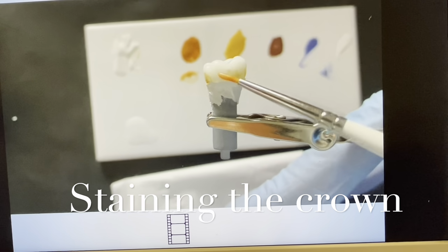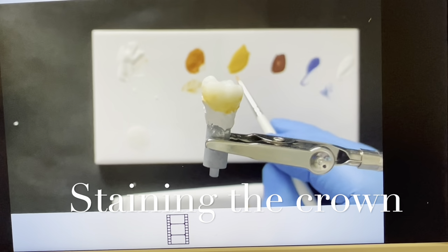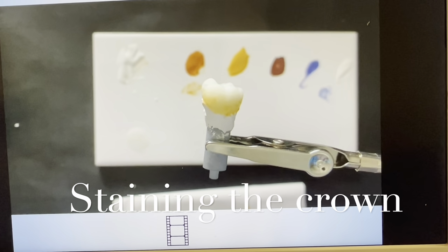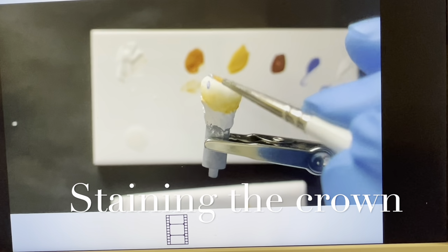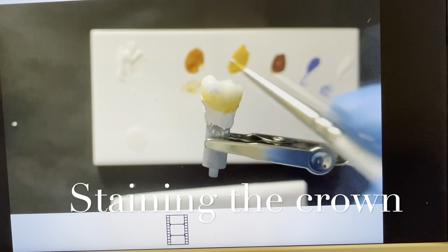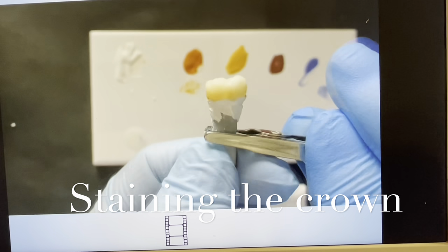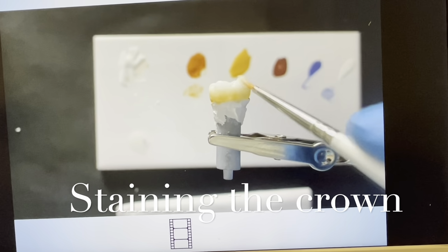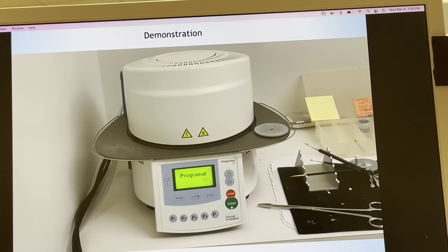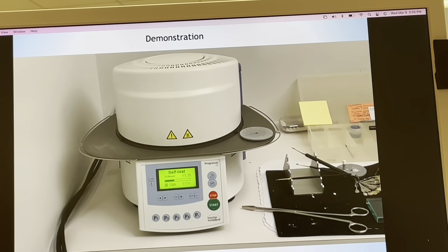As you can see, I'm doing it a little heavier just so you guys can see it on the camera. I will clean it later on. I just move on into the incisal area, and that is to imitate translucency. We're gonna apply a little bit of the blue, a little heavier right there, and I realized that it was just too heavy, so I go into the mixture that we make between white and blue, so it will give us some kind of a purplish or light blue incisal translucency. White on the incisal edges to make sure that it looks like some kind of a halo. We have finished the restoration.